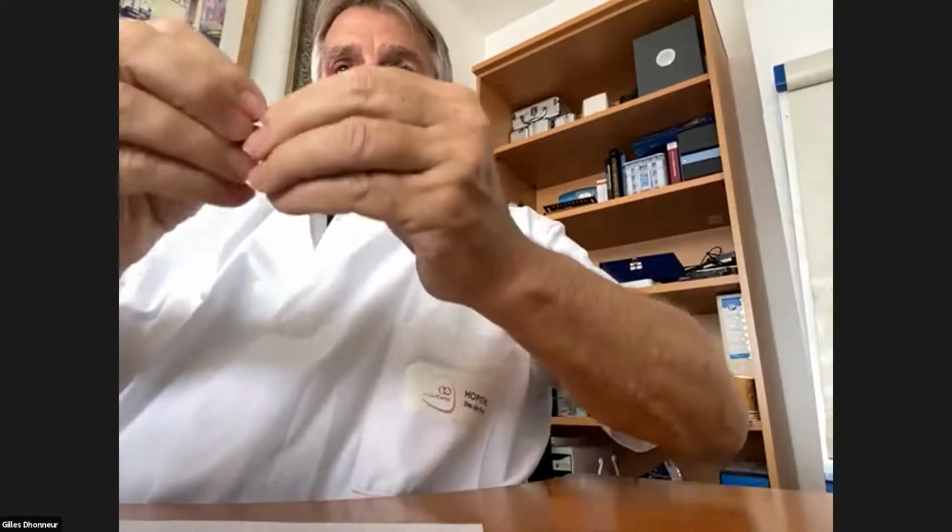If you give pressure to these patients, we thought that we could use only pressure, only air. If you give pressure, you improve the edema in the alveoli. So you increase the residual capacity, which means that you improve the oxygen store in the lungs. So if you give pressure and oxygen, you treat the patient, and they are less likely to injure their own lung trying to inspire, because when you try to inspire, you alter your alveolo-capillary membrane.